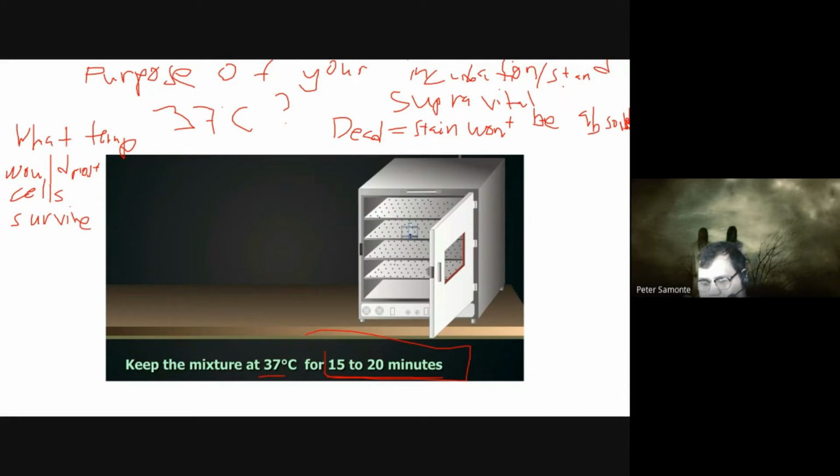Ano ang purpose ng standing time or waiting time nyo kapag nagsistain kayo? Sa microbiology nyo class, if you recall sa gram stain, bakit kayo may mga waiting time? May 5 minutes, may 2 minutes. Para saan yung mga yun? It also has the same principle sa reticulocyte count. Or in any staining technique, there is also a waiting time para mag-mix ang reticulocyte sa stain.